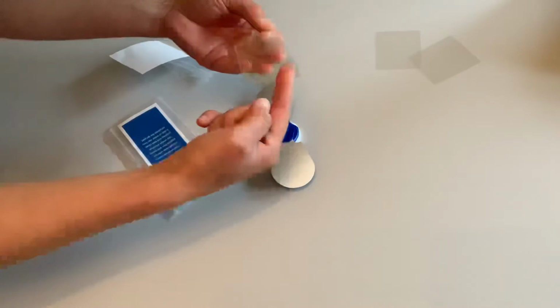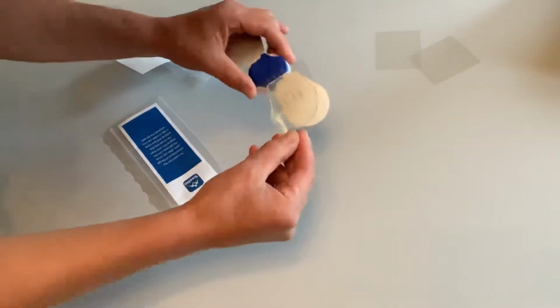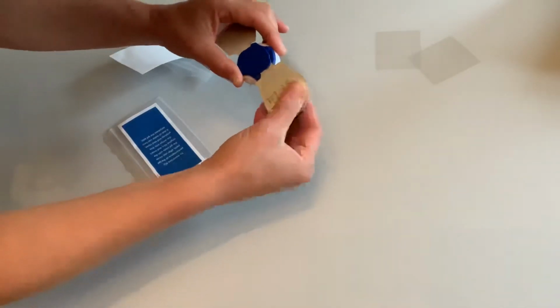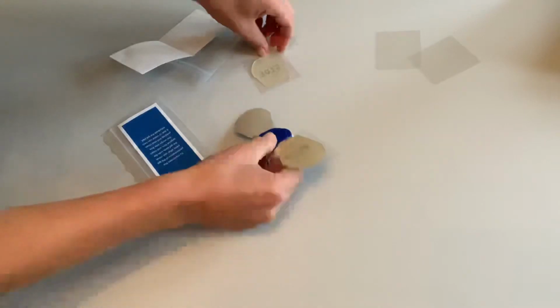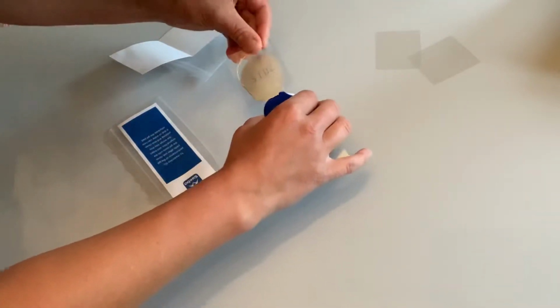Then going to place, keeping this plastic film on, I'm going to place my gel electrode, line it up with the wing, exactly the same on the other side. Line it up with the wing.